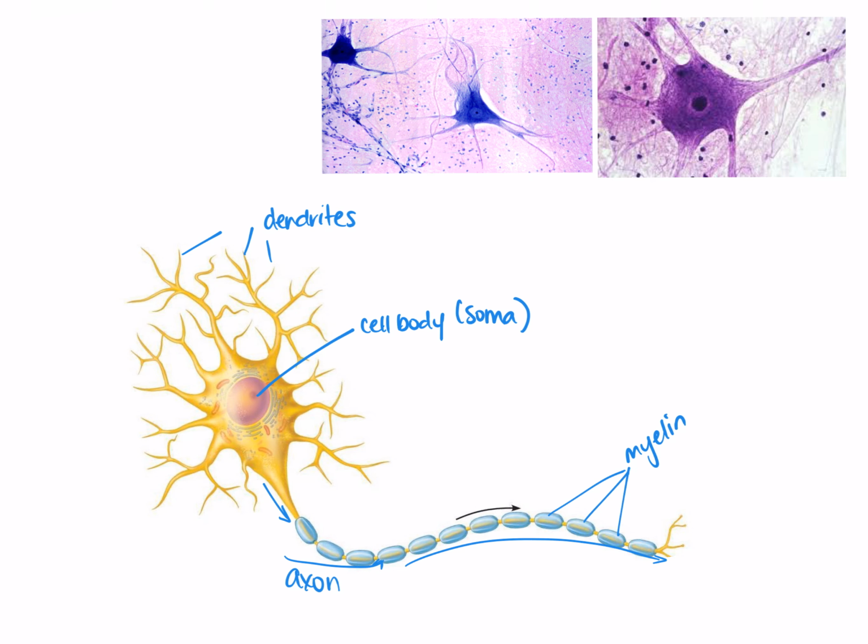What about these gaps in the myelin sheath? I'm glad you asked, because the gaps are really important for action potential transmission, or neurotransmission, to happen, because it propagates that nerve impulse really, really quickly, only because of these little gaps. The specific name for these gaps is node of Ranvier.